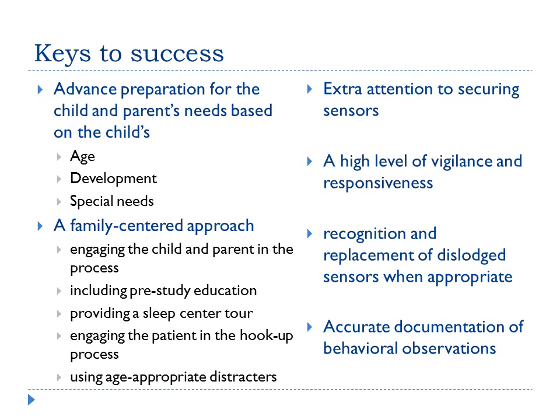As far as running your study, you want to pay extra attention to securing your sensors before lights out. This will save you headache after headache if you do a good job with this. Maintain a high level of vigilance and responsiveness during the study. Recognition and replacement of dislodged sensors when appropriate.